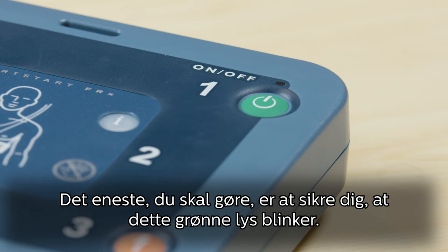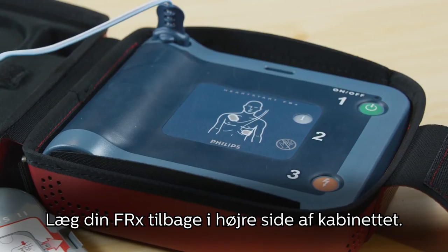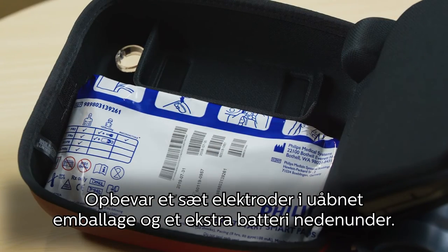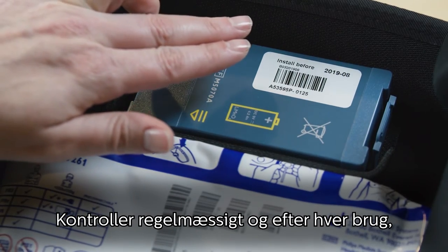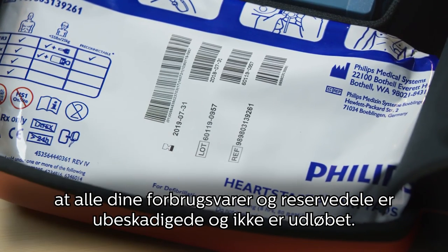All you need to do is make sure the green light is blinking. To store your FRX, put the device back into the right side of the case with the pre-connected pads on the left. Store a set of pads in their unopened packaging and a spare battery underneath. Periodically and after each use, check that all your supplies and spares are undamaged and unexpired.